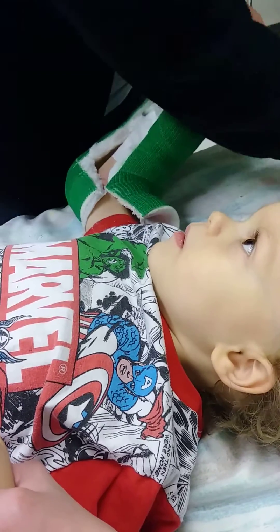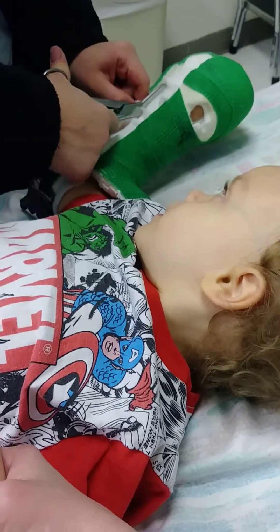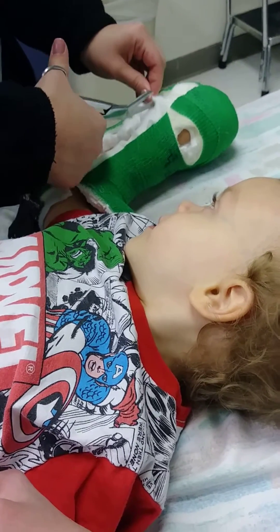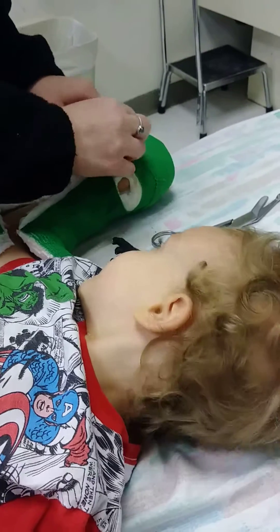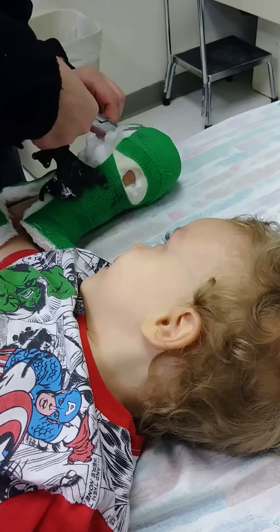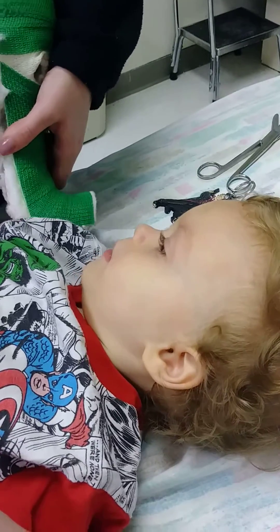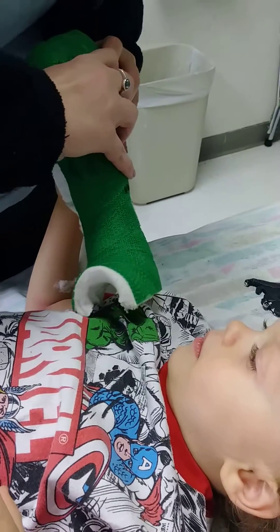She has to, honey. They've got to look at your finger and then get a brand new one. If you want blue you can get any color you want. Your finger's getting better and you'll be able to move your hand a little bit because it's been all cramped — your fingers have been separated the whole time. It's all right. I know you've wanted to get that off.